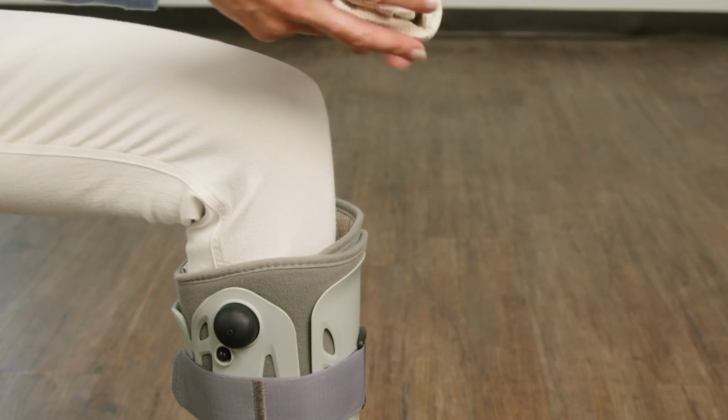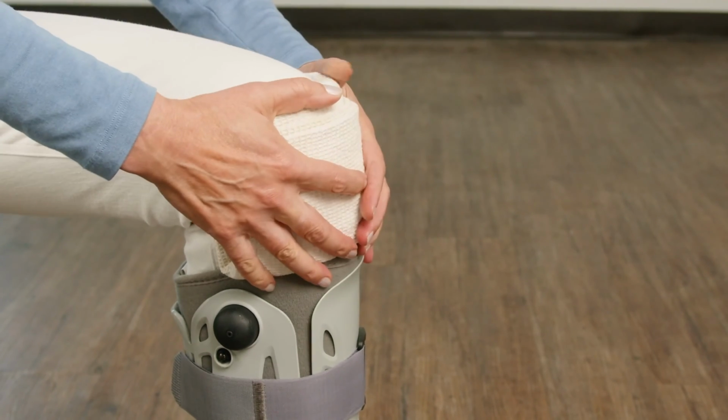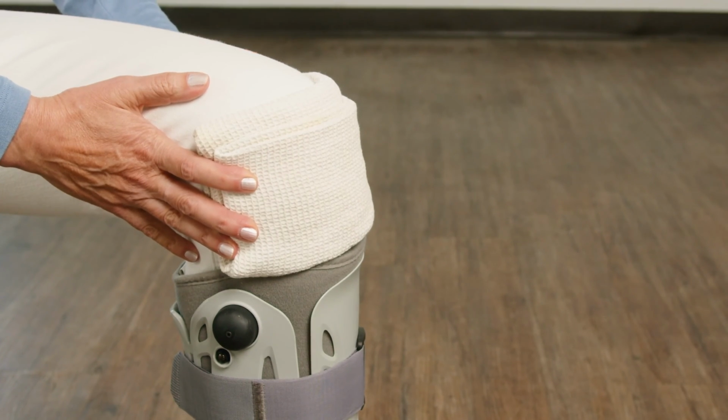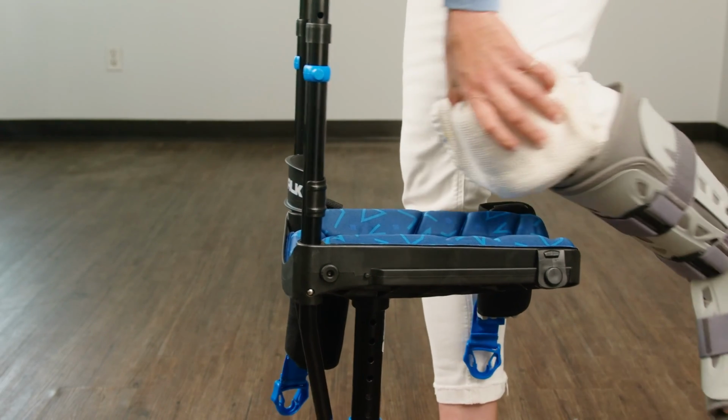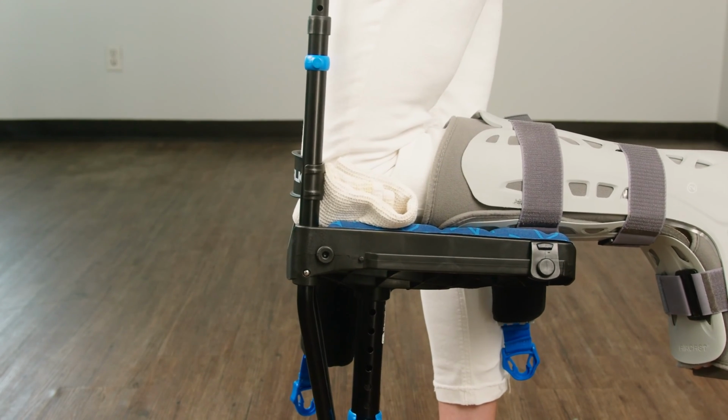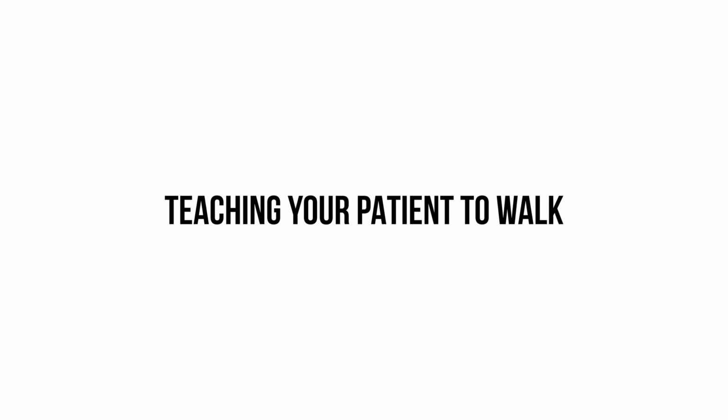Simply add additional padding to take up the space directly above the end of the cast or boot. A folded towel works great, or you can add additional padding from any source. If using a towel, make it thicker than you think it should be. It will compress when the patient puts weight on it.